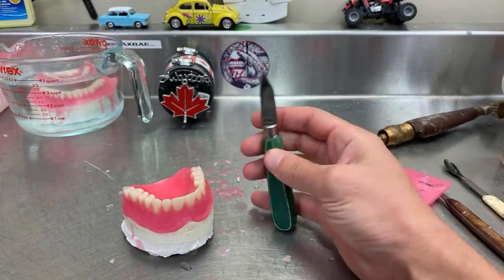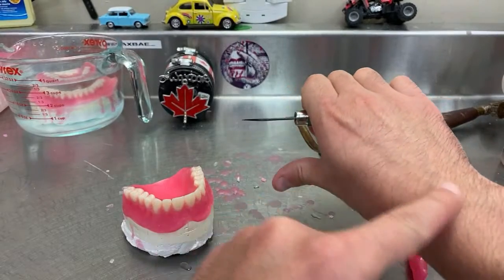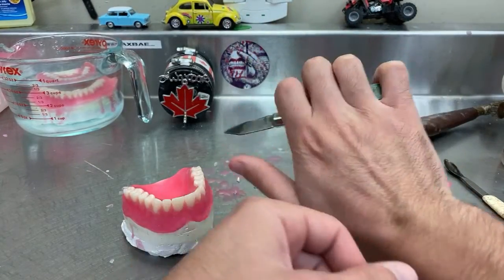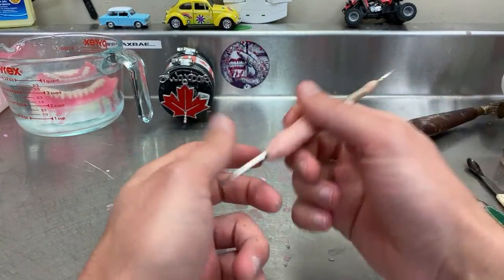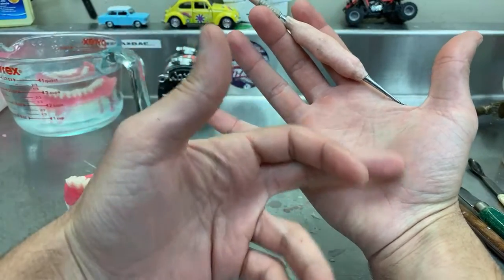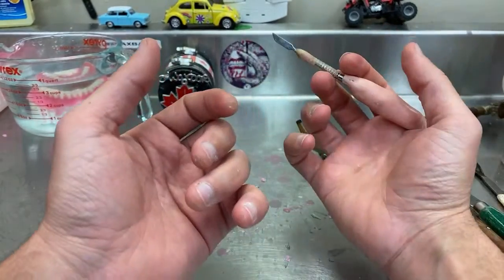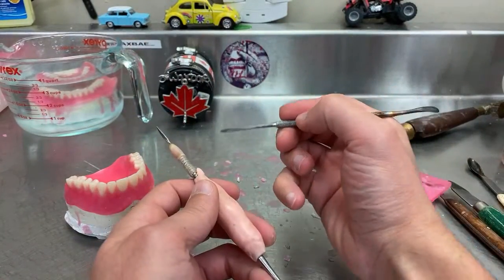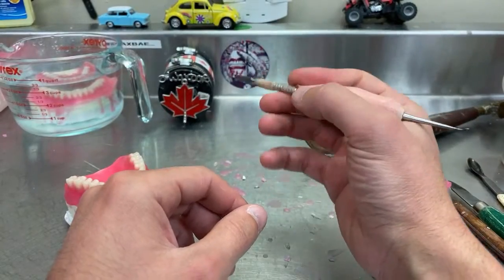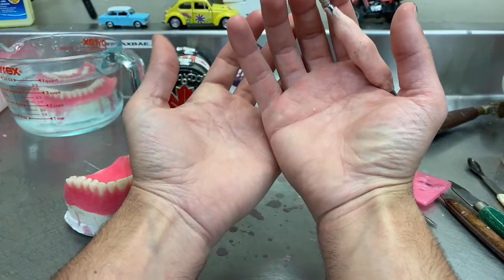I used to do my festooning with this because it was easier to hold and everything. But that position here can cause some damage when you do it too much. Because carpal tunnel, I can see it around the corner. This here is modified to avoid cramping. Because I always mention that when you're working, it's mostly this muscle here and all your nerves. So if you're holding something skinny like that and you work too much, oh my god, you will not be able to feel it. But to have a grip on it, it becomes somehow easier. It still hurts, but I don't know if you can see, I think this muscle here is usually blue.